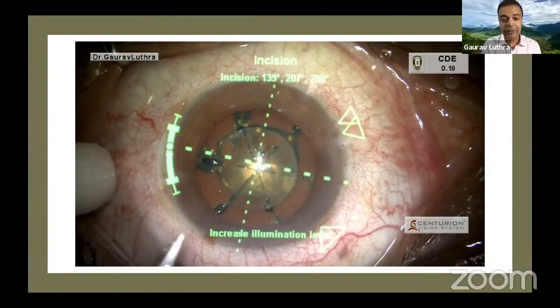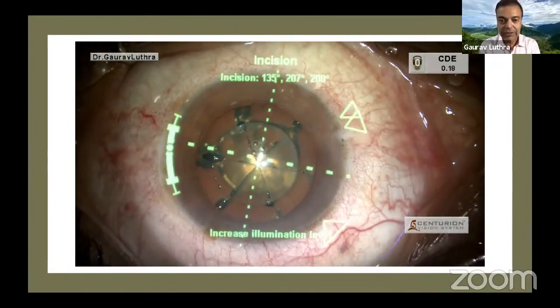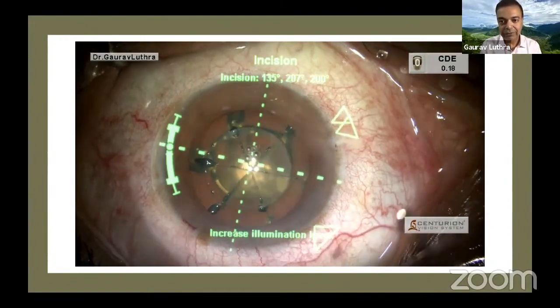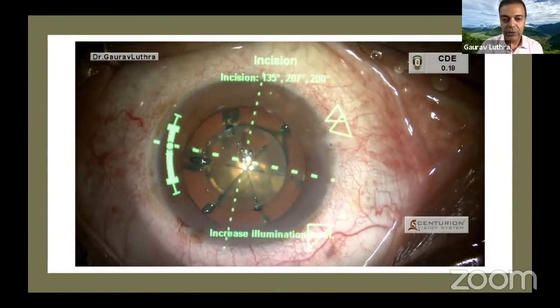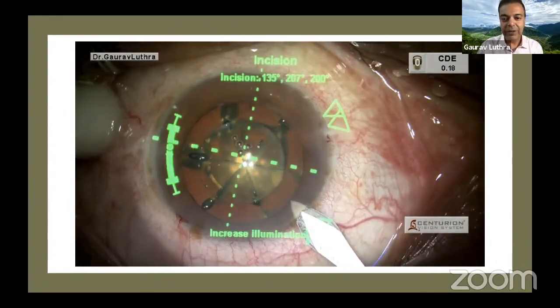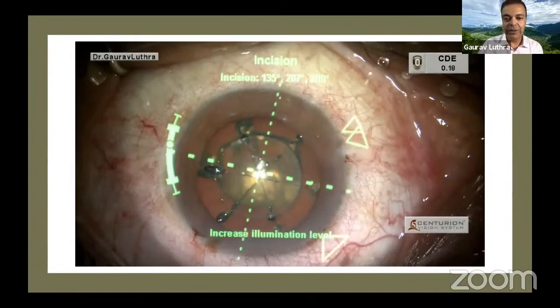It's not probably recommended, but for the sake of compromising on the cost that we incur, we do plasma sterilize a couple of times. But I won't recommend it. But off label, I can say that they still continue to work beautifully after a couple of autoclaves as well. And you can do a good surgery there. You can again see that here with minimal pressure, I literally have to hold my hand back because it goes in sometimes so fast that you have to be a little careful.